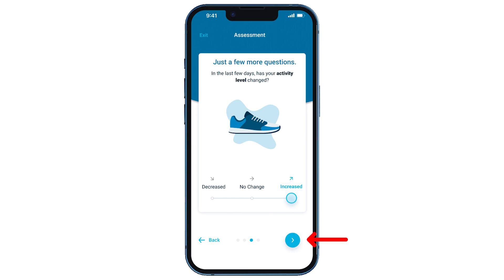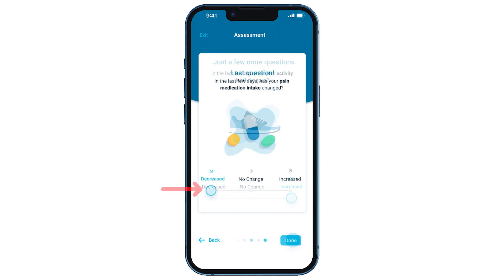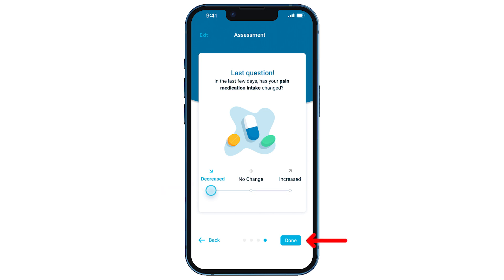Last, you will tap the arrow to complete the final question where you will note if you have had any change in pain medication. Once you have answered all the questions, please tap Done to save your assessment.